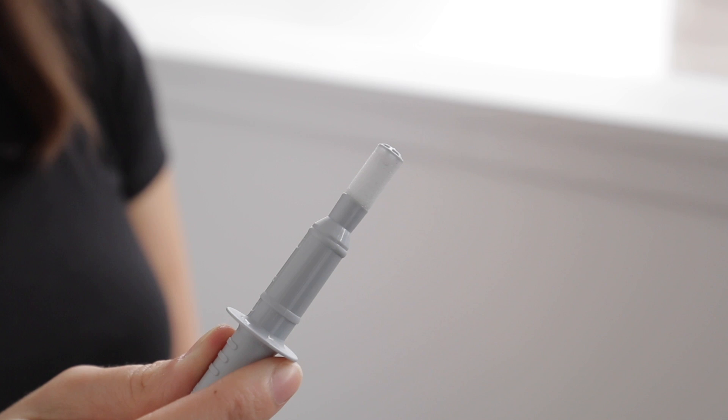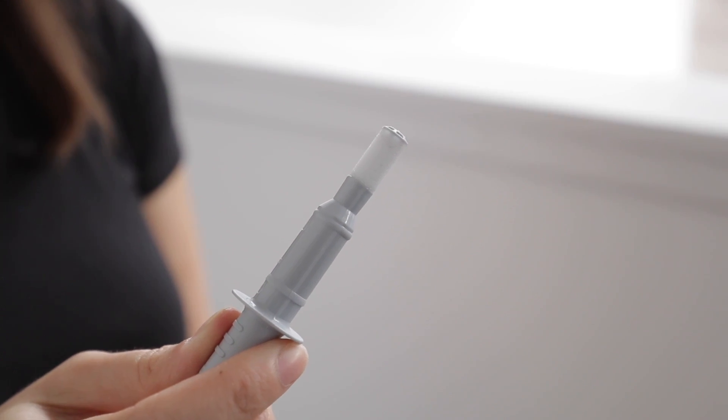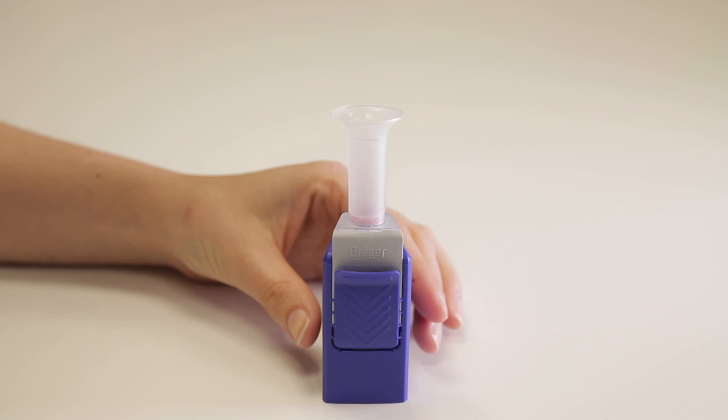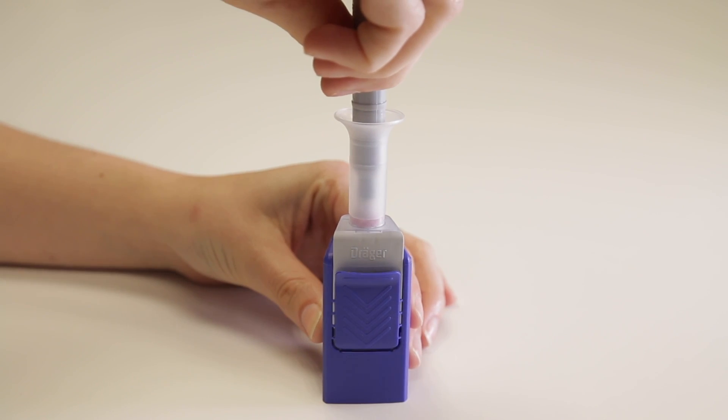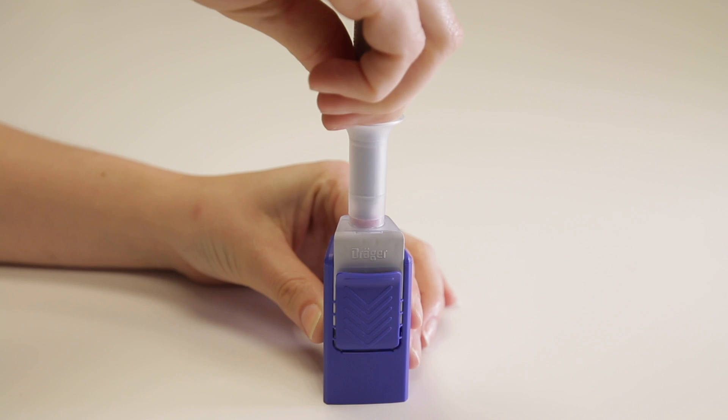Once the red ring on the sampler starts to discolor you can remove it. Now push the sample into the funnel on top of the test cassette. The vial inside the cassette which houses the buffer solution should break.